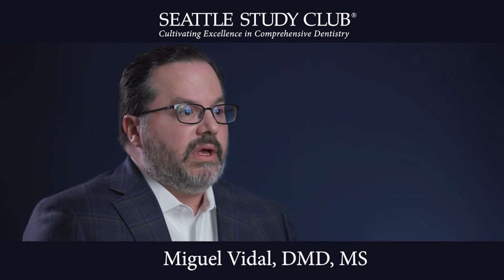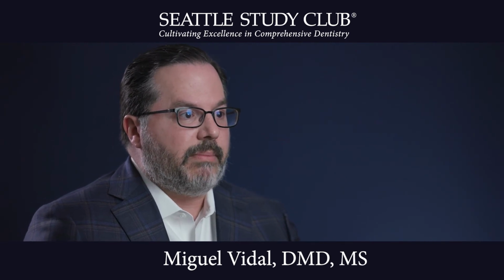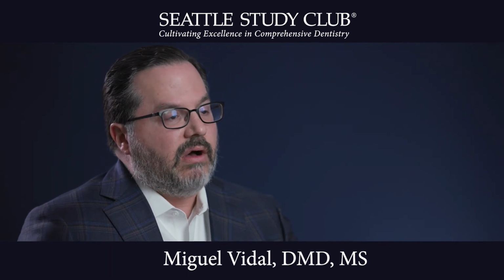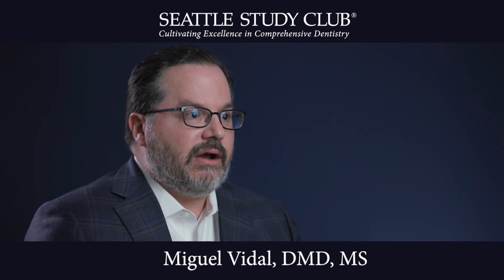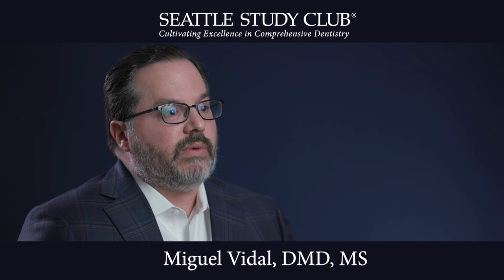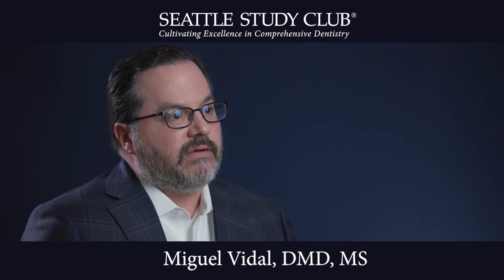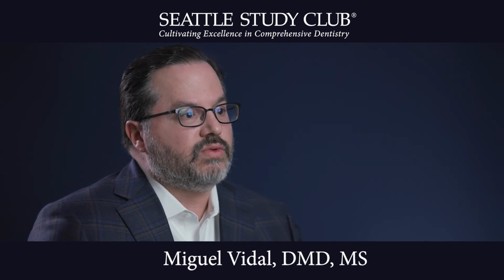So what we want to do is really emphasize surgical implant positioning and having the right depth, not just for the emergence profile, but also for the positioning of our implant abutment height, our margin, and be able to access that area very predictably for cement retained restorations, and even with screw retained restorations, to make sure if we're using a Ti-base solution that the cement interface is not located too far subgingival, because we know that can create issues with the soft tissue.